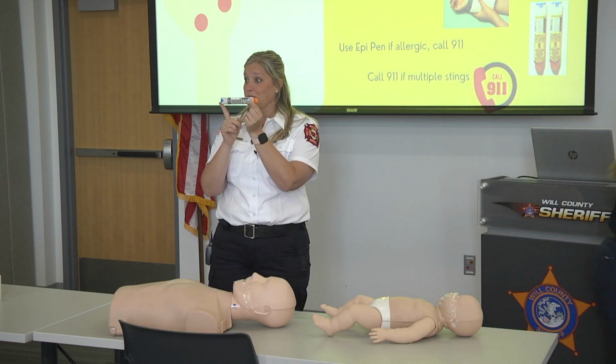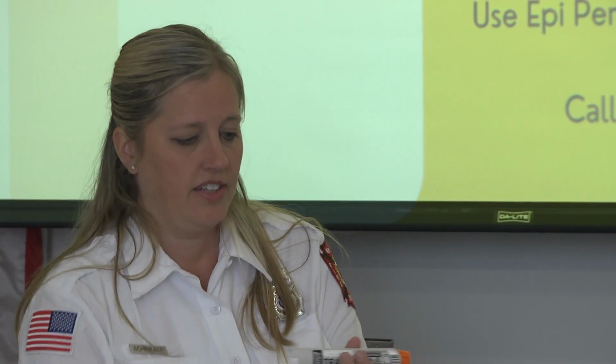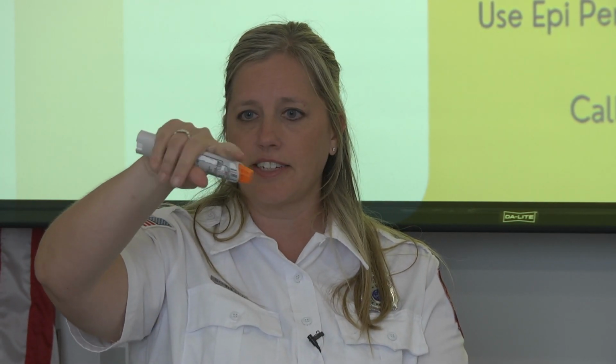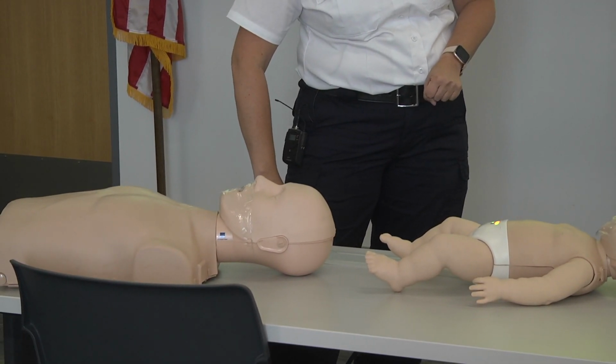So this is usually what the kind that you're gonna see is gonna look something like this. You're gonna take this blue part out. Then you're going to take it in your hand. Never put your thumb again over this side. Instead, make sure that your hand is in the center. You're going to find the side of their leg, like their thigh, and then I'm just going to push it in there.